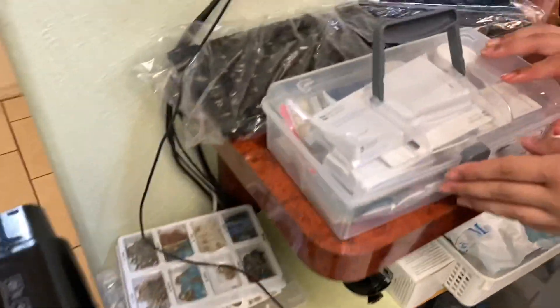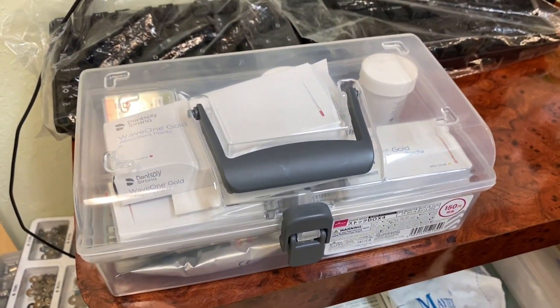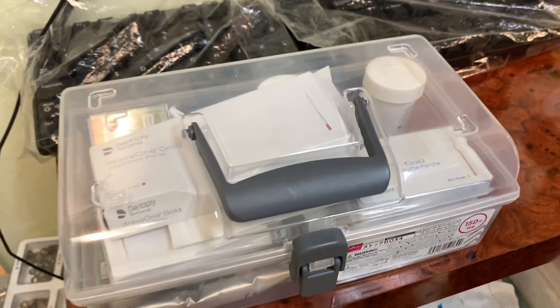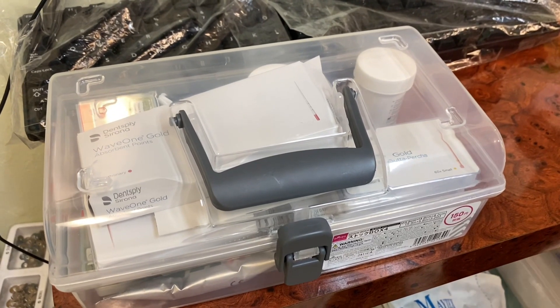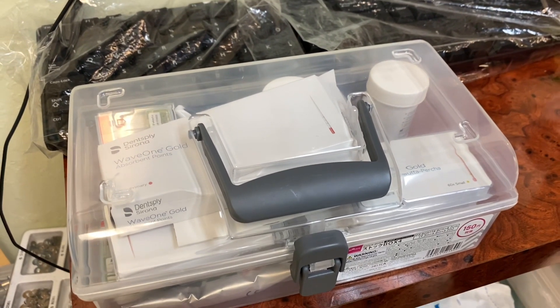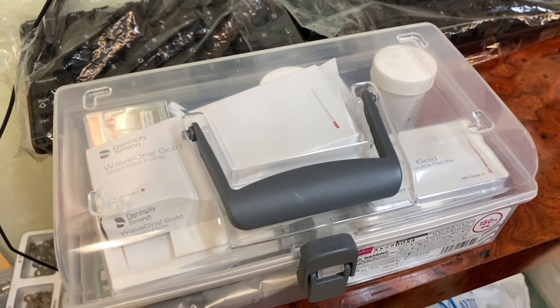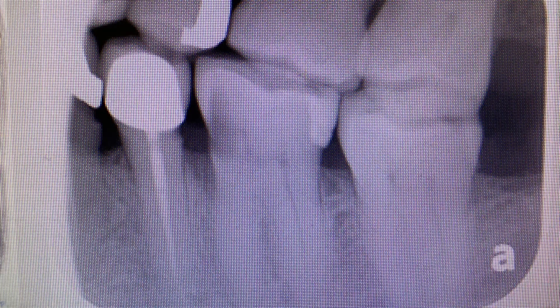When I get ready for endo, this is all I need — just a tiny little tool. It comes with a couple of universal sizes and I've just been loving it. Keep it simple, guys. Don't let endo stress you out. I don't use much of the hand file anymore — Wave One can do most of the job.